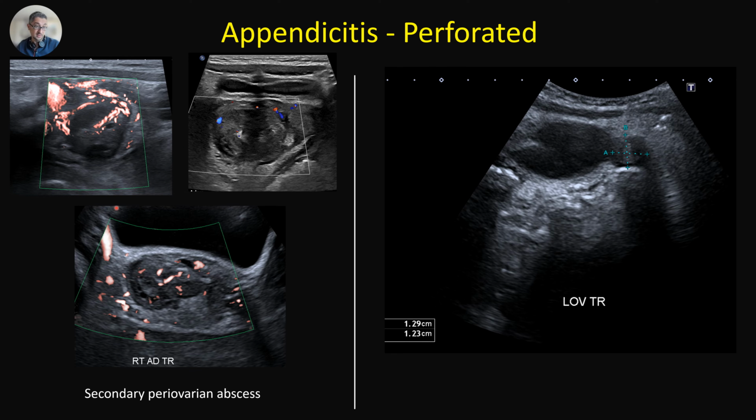That's why it looks hyperemic, hypervascular. And for comparison, this is the left ovary. This is the right ovary with abscess. So reactional hyperemia, hypervascularity doesn't happen in ovarian torsion. No such thing happens, but this was actually just the abscess because the appendix was extending to the ovary, and after the perforation, the abscess was around the ovary. This was actually a paraovarian abscess, mimicking an ovarian pathology.